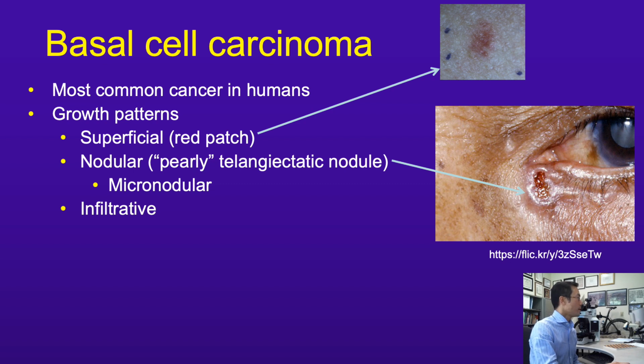One more comment about the subtyping of basal cell carcinoma. It is something that we as pathologists should attempt to do in every instance. It may not be possible in every case, and in that case it would be appropriate to say that the sample doesn't permit subtyping. Multiple studies have also shown that subtyping basal cells off shave and punch biopsies is not super accurate, maybe 80%, so not bad, but definitely far from perfect. But the reason that we strive to do the subtyping is that the subtypes, depending on the exact situation, can determine the range of treatment options that are available for the patient.